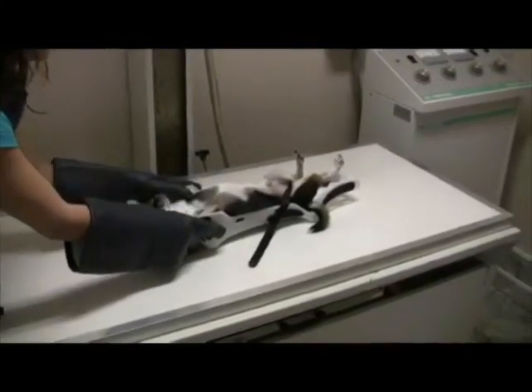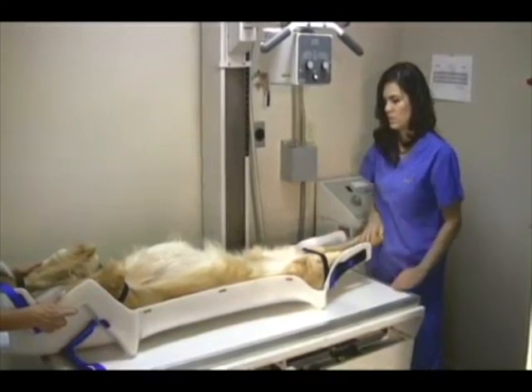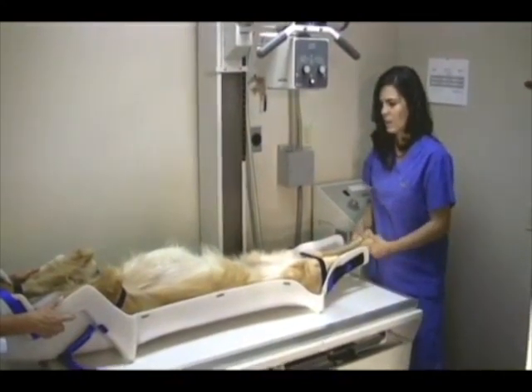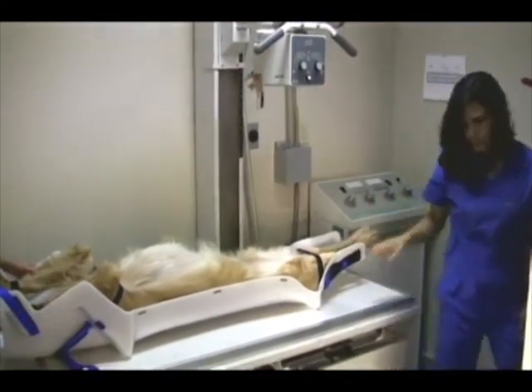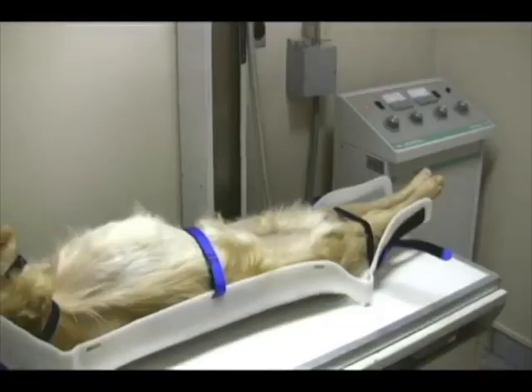Extended view hip films can be taken on sedated or anesthetized patients hands-free in a fraction of the time it takes to hold them the conventional way, and in almost all cases, the positioning is far superior.